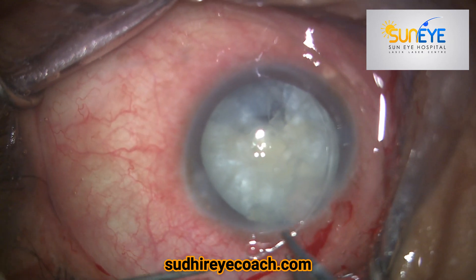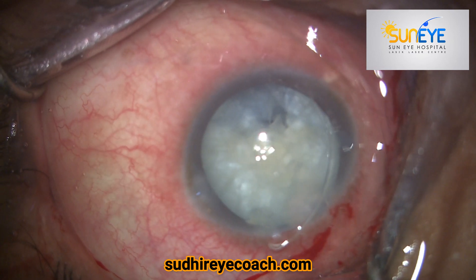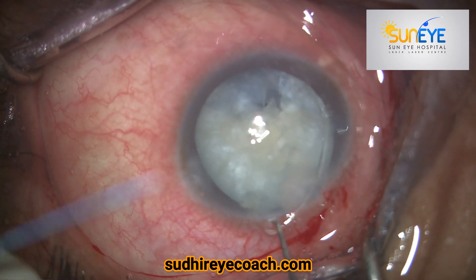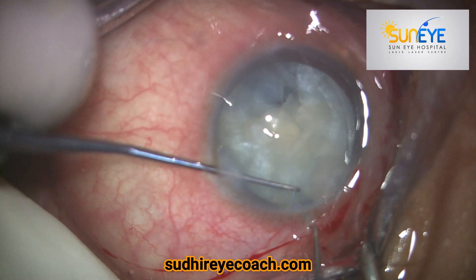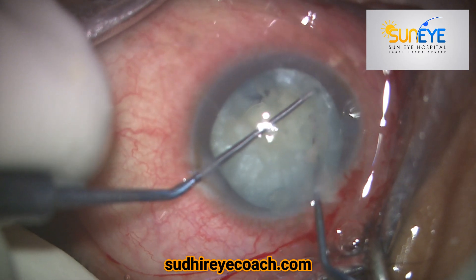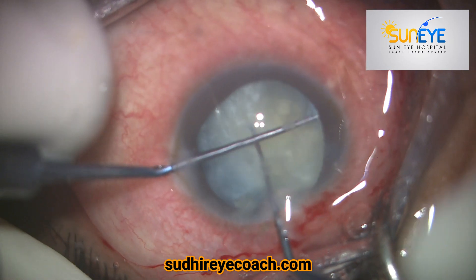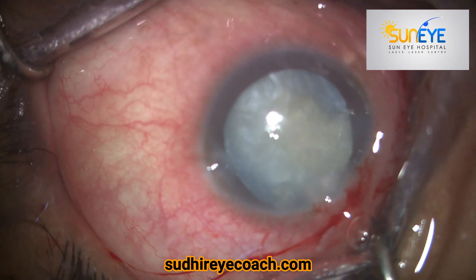You can use forceps to hold and insert the bag with the handshake technique. I personally use two Sinski hooks — insert it and lock the endocapsular ring tip with the second Sinski hook — and you can easily dial it inside the bag.